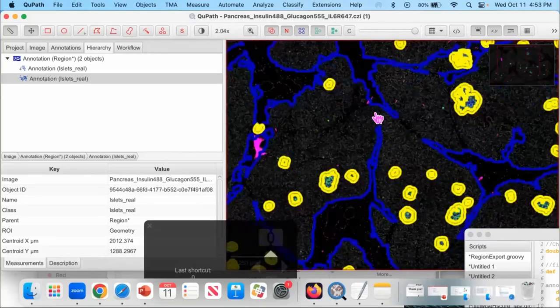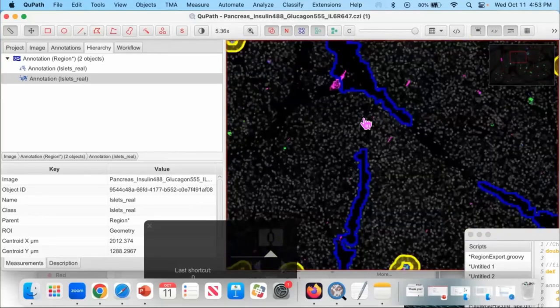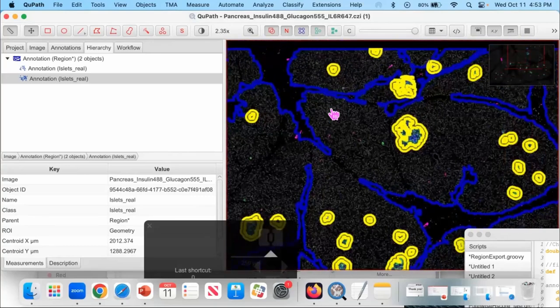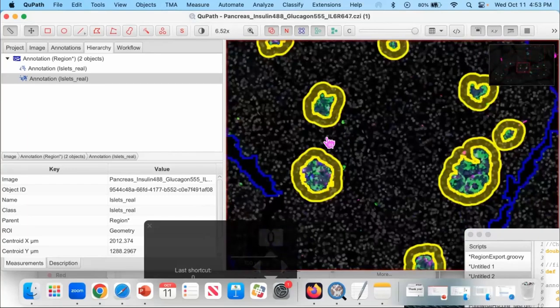Lobes are hard, and I have spent an enormous amount of time trying to automatically draw lines like this, where you can see that it's supposed to be a different piece of tissue, but it's not always there, and I cannot reliably succeed.